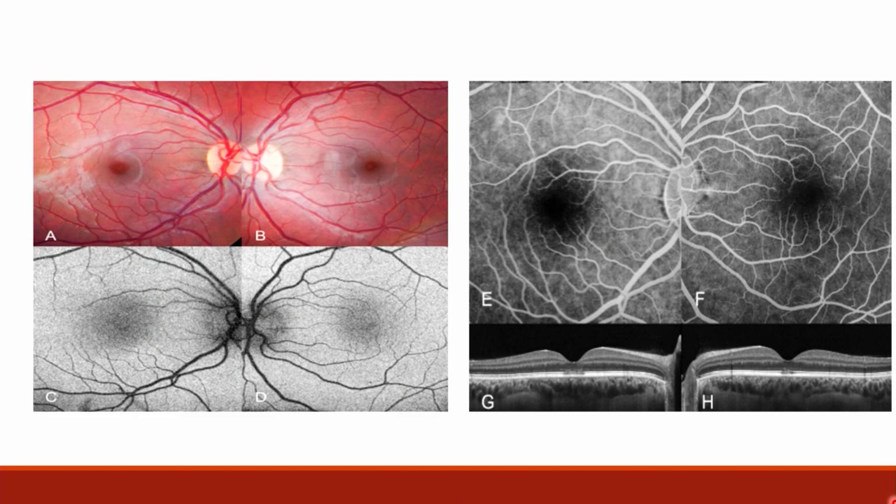The right eye again showed hypopigmented pale lesions. The FFA and the autofluorescence both were unremarkable, did not show any changes. While the OCT again showed mottled hyperreflective lesions outer to the external limiting membrane, which resolved on follow-up.